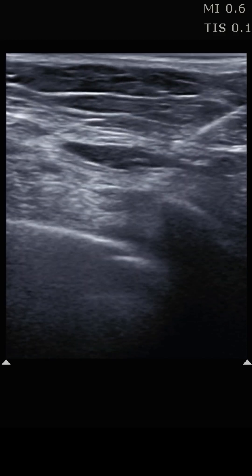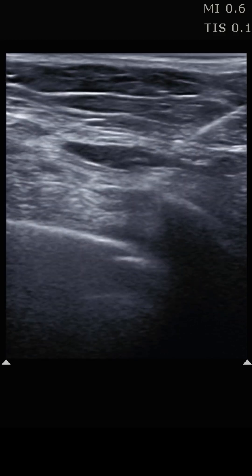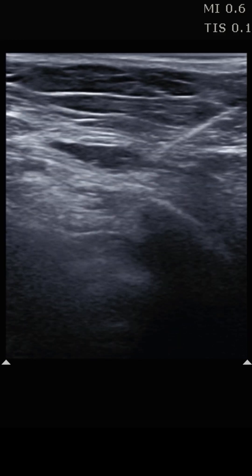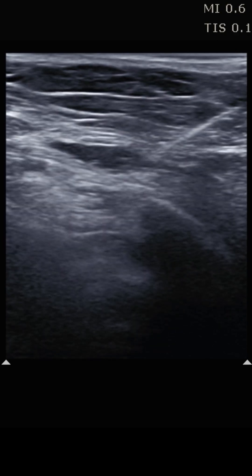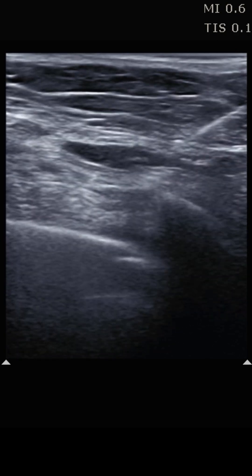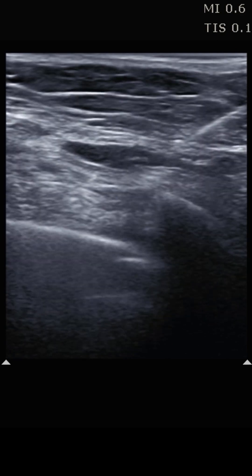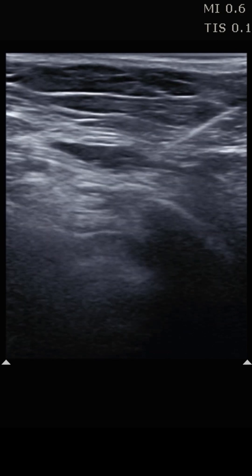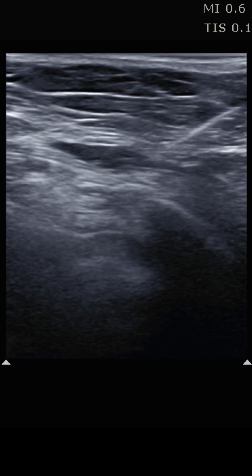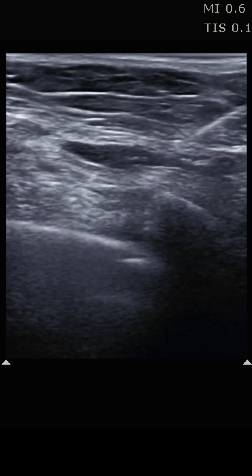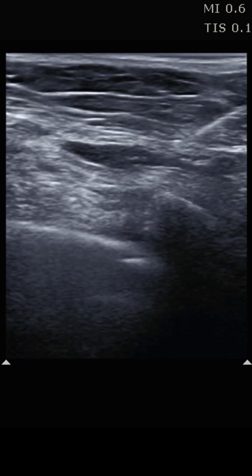In the last video we talked about the serratus anterior plane block, the normal anatomy, and the ideal location for where you deposit your anesthetic when doing this procedure. In this video, I'd like to show this block in action. This clip comes from a patient who had multiple rib fractures as a result of a pretty significant traumatic injury.